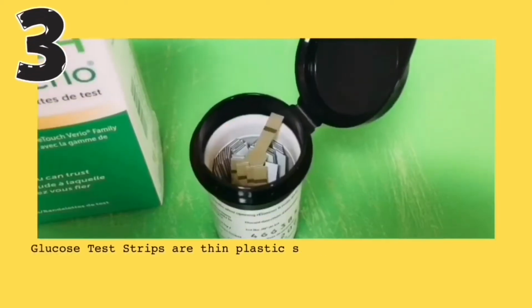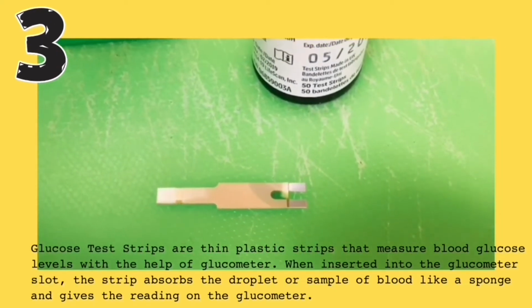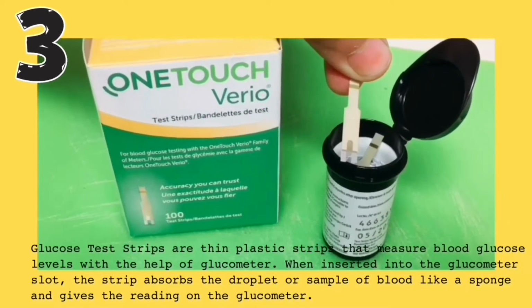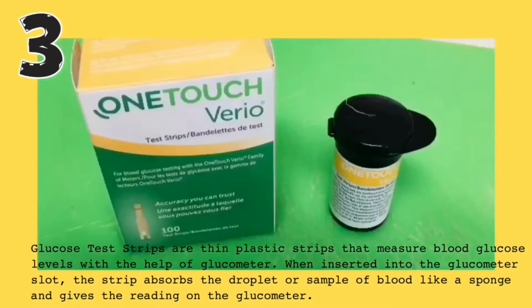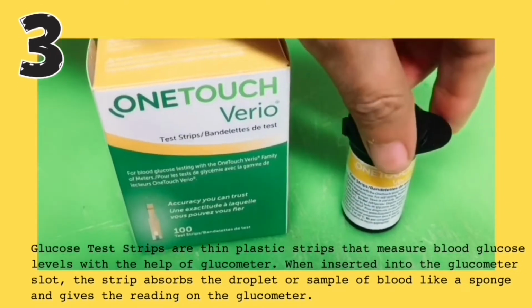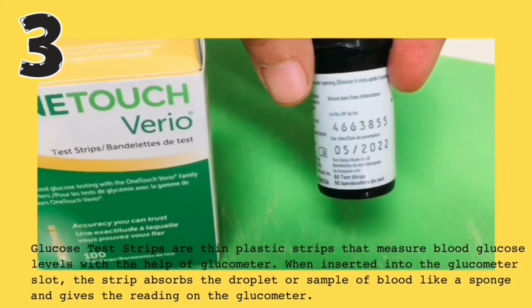The third most important supply we're gonna need is test strip. So glucose test strips are thin plastic strips that measure blood glucose levels with the help of glucometer. When inserted into the glucometer slot, the strip absorbs the droplet or sample of blood like a sponge and gives the reading on the glucometer. Make sure to check the expiry before buying the test strips. Otherwise, the test strips won't show the right reading.